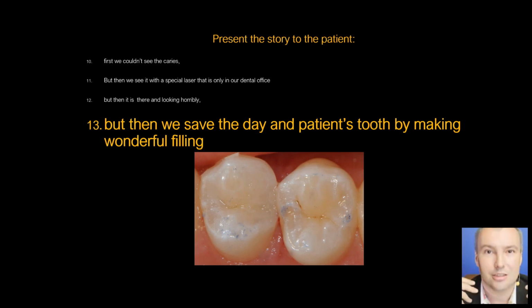And then we get the whole story. We couldn't see the caries. It was there, we found it thanks to our special powers. Then we found it inside with the drill. We found how large the cavity was, and then we saved the day by filling the tooth. This is the story patients need to hear, not only for us to be clinically perfect, but also to please the patient, to make him, in his head, a happy patient that is sure he is treated.